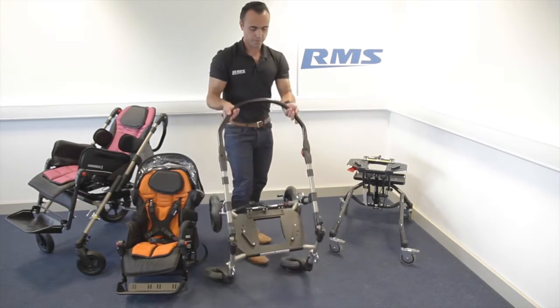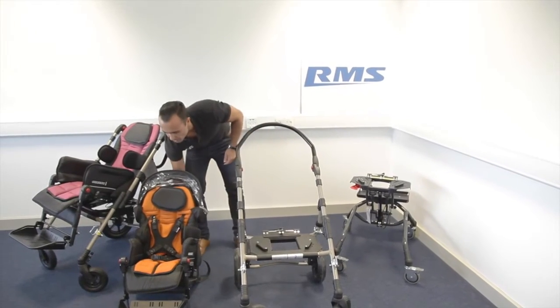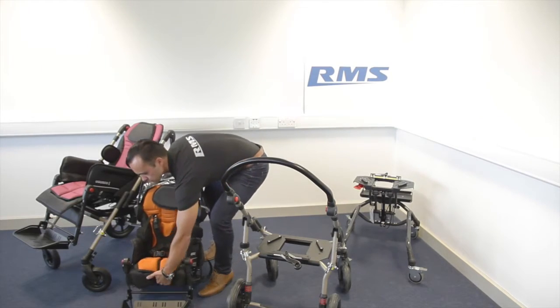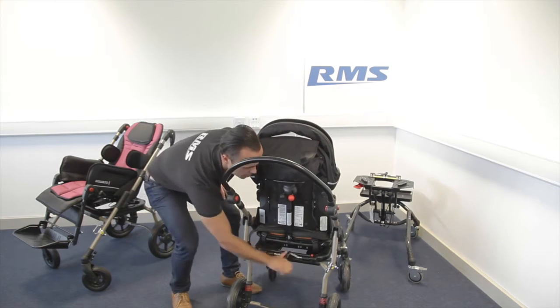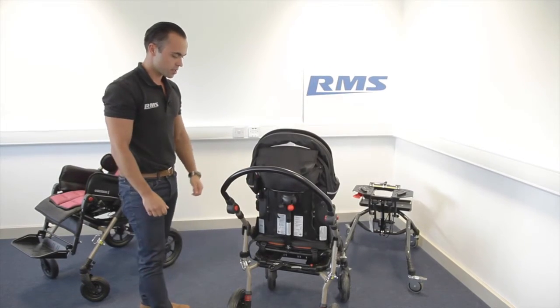To unfold, that's it — it's locked. Then slide the seat back on, lock it, and always make sure that it's secure.